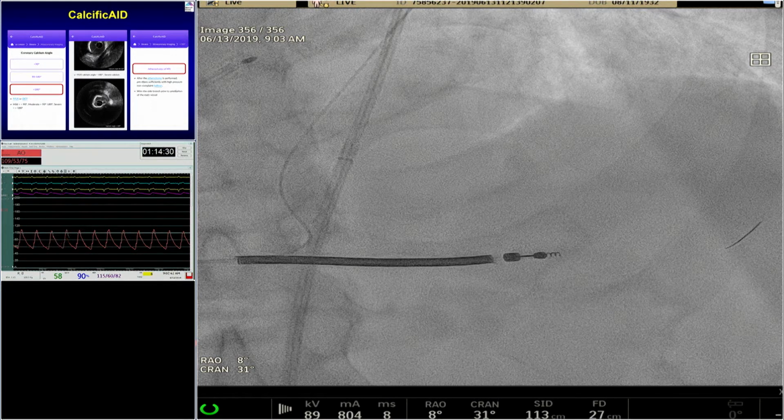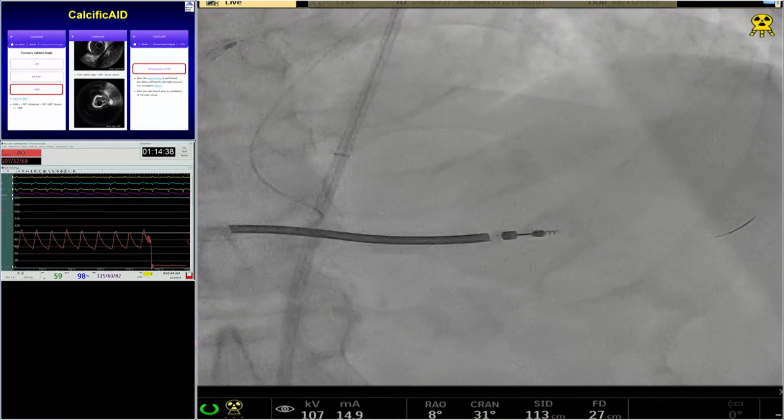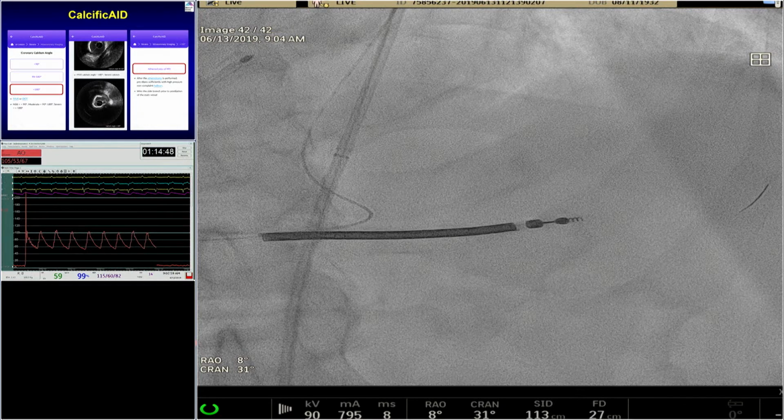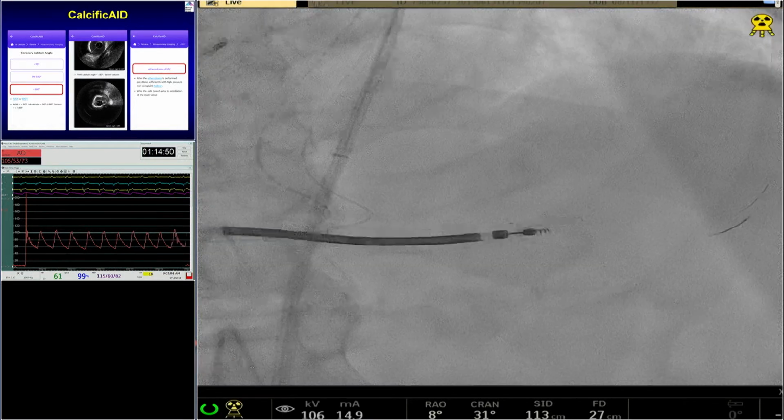So let me just tell you the 3 steps. We still do the 3 steps. Just take out the tension, the Y connector, where you can take the tension between the burr and the wire. And what I'm going to do is start burring right from the ostium so that the mid part of the left main is taken care of, and then go to the LAD. Now we'll just see the dyna, final.